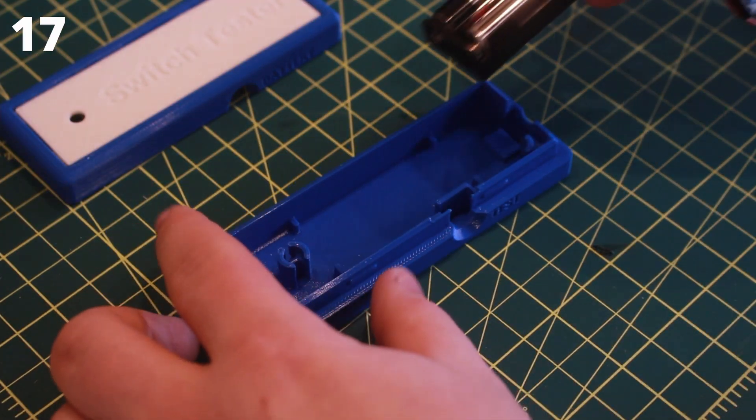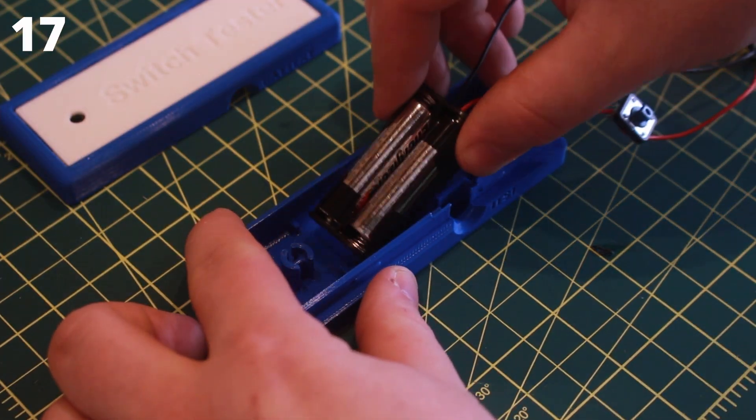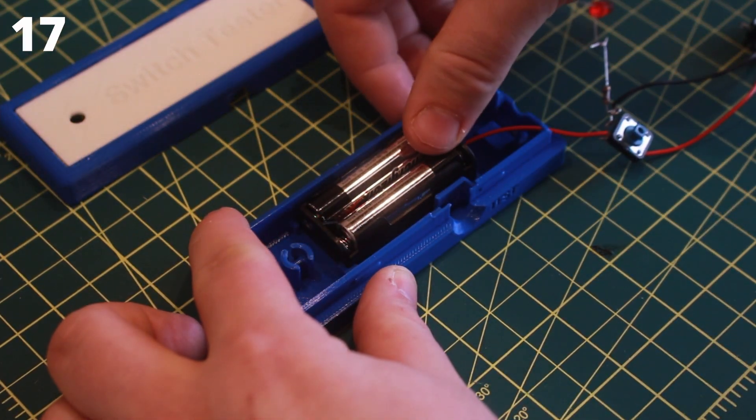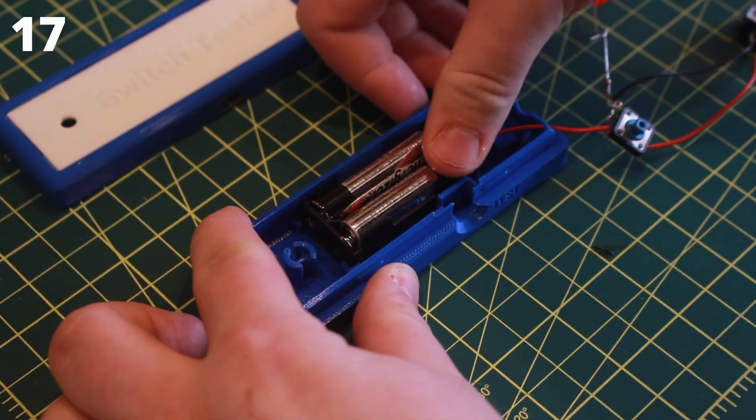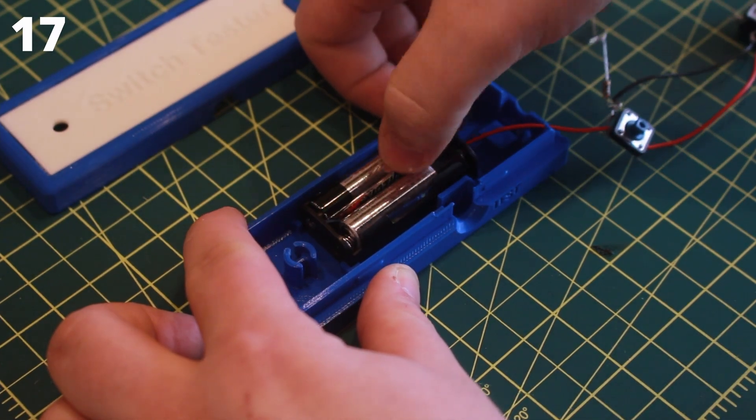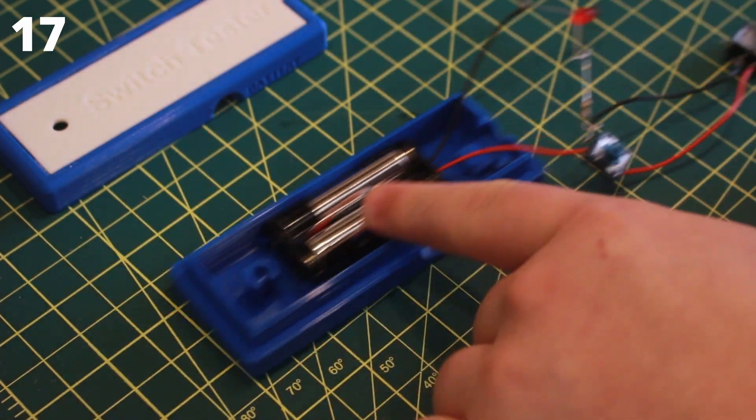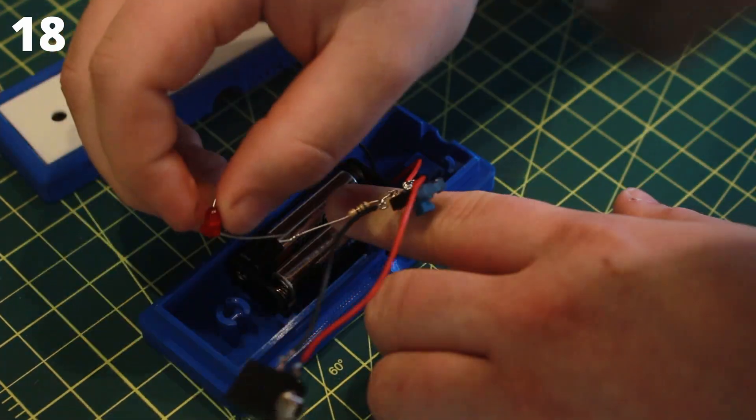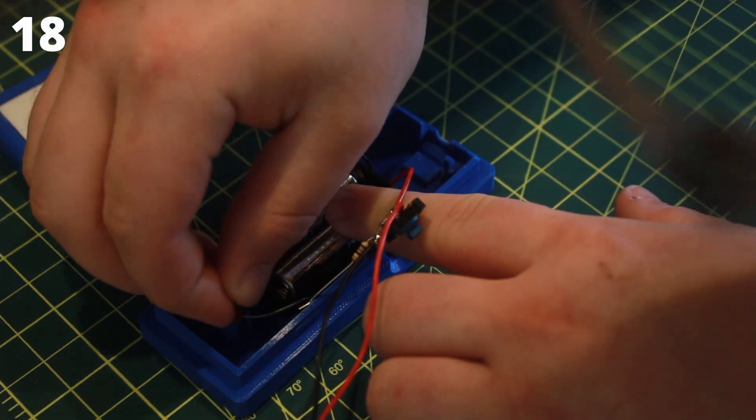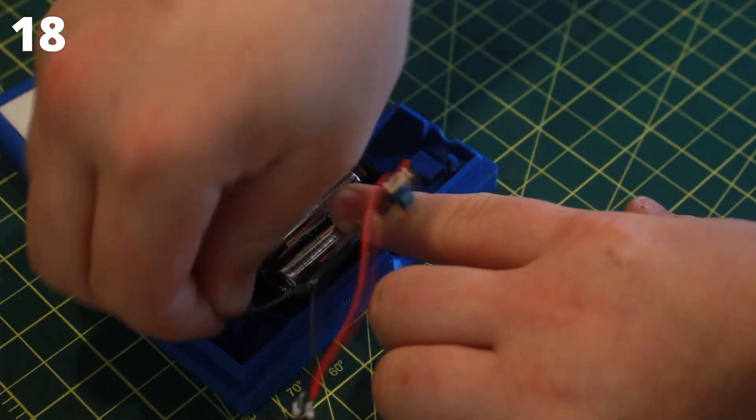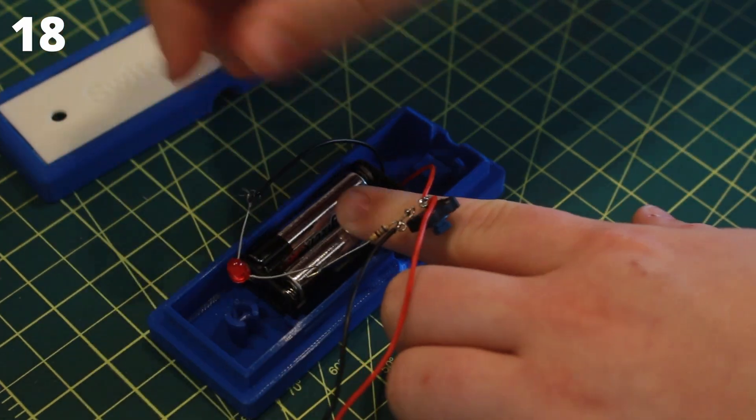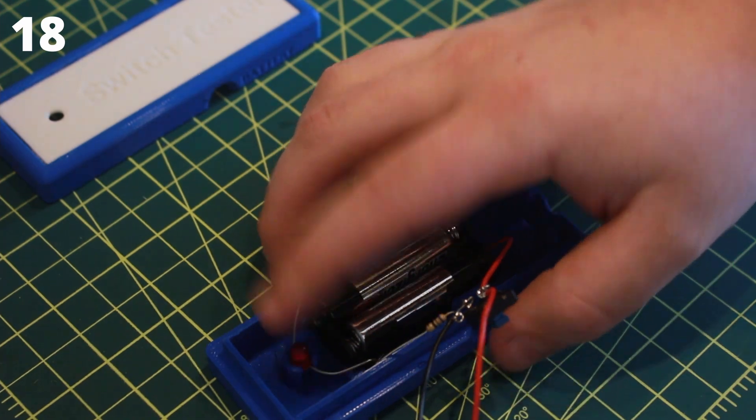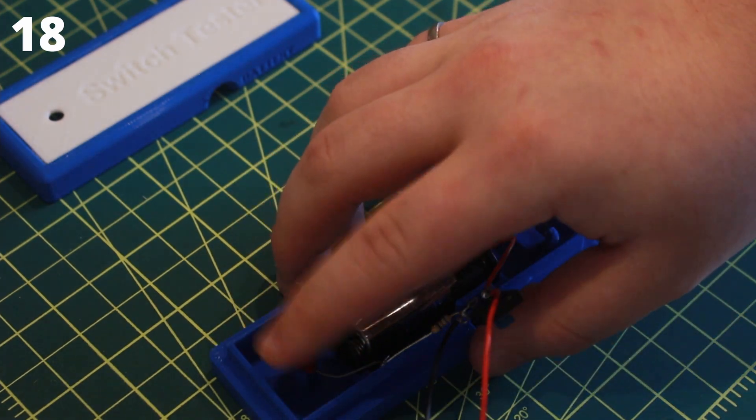Now take the bottom enclosure and place the battery holder into the slot. Ensure the wires are facing the right side. Take the LED and fit it into the round hole on the left side of the enclosure. Press down gently until it is secure.